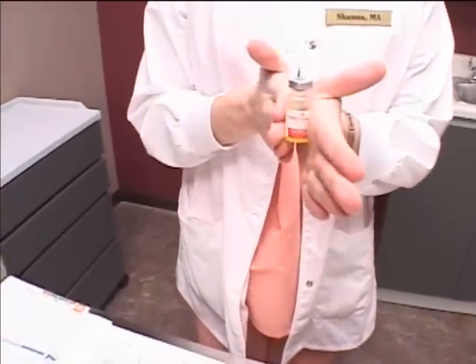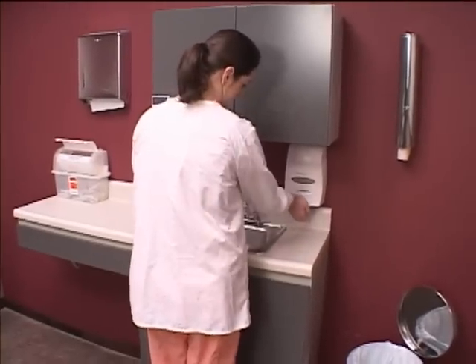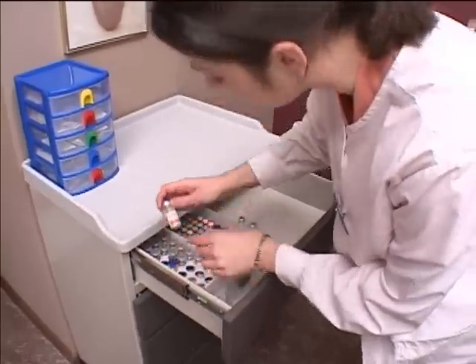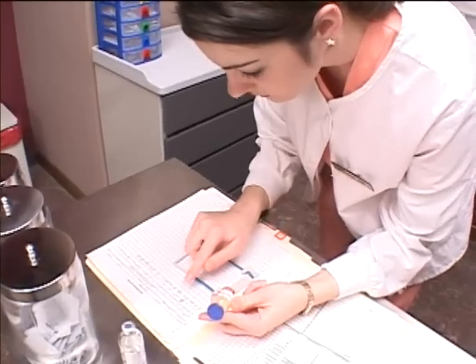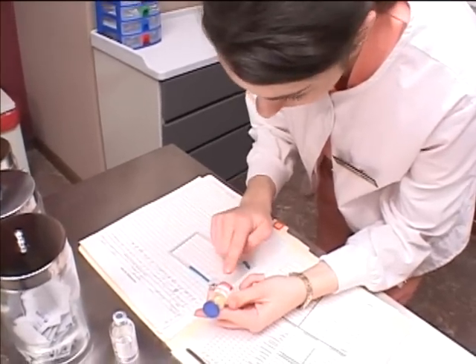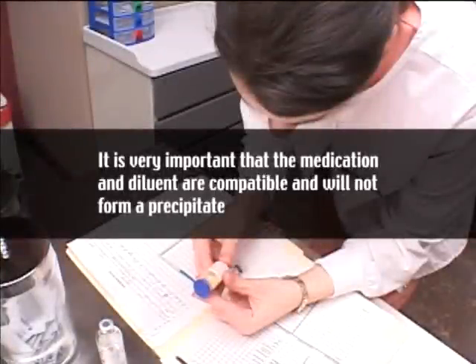When ordered to reconstitute powdered medication for administration, you should begin by washing your hands. Select the appropriate diluent and powdered medication vial and prevent error by verifying it against the physician's order for the 6 rights. It is very important that the medication and diluent are compatible and will not form a precipitate. Check medication order for specific instructions.